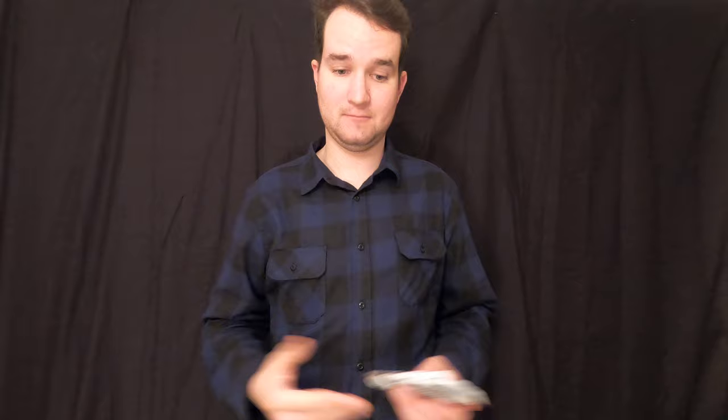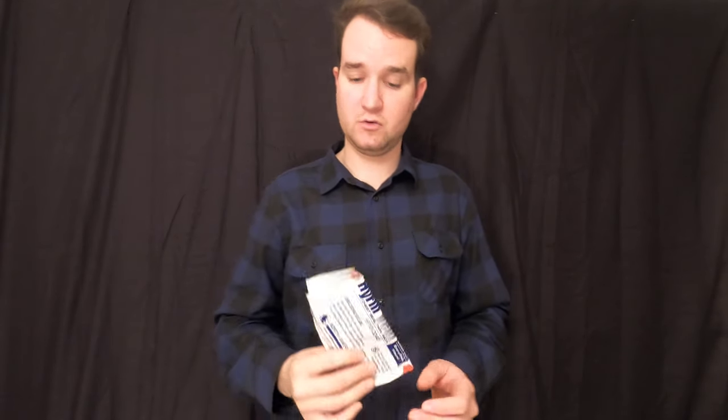Now, when you have them, you're gonna be putting them on an open wound specifically in the torso area, so that you're not getting air into the lungs. A lot of times with that, it can cause a lot more damage, collapsing the lungs, things like that. So we're wanting to cover that so that it can be sealed and we're not having any problems with that.